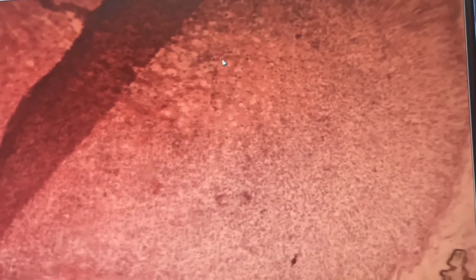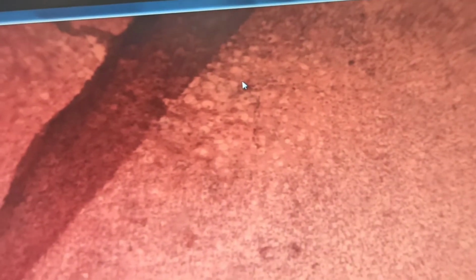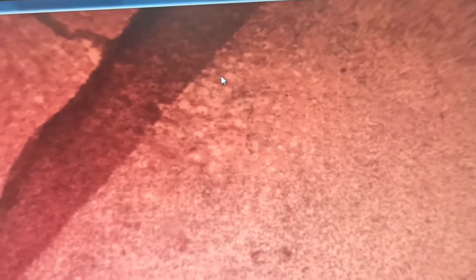These cells are called chromaffin cells. We have chromophils in the hypophysis. So these cells are called chromaffin. And aldosterone is secreted in zona glomerulosa cells. I can check the cortex layers here again.